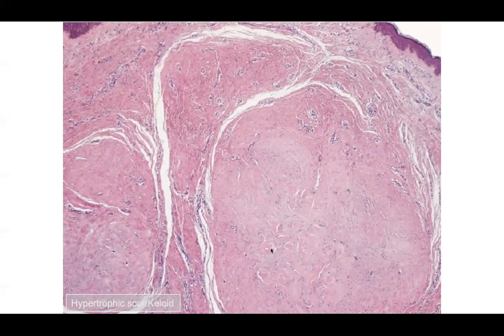There is the beginnings of keloidal collagen in the center of this, but what differentiates a hypertrophic scar from the keloidal collagen is that you'll see pretty normal collagen thickness in strands, but it's going to be arranged in these well-delineated fascicles. And you can often get this at the periphery of a keloid. So if you just get a piece of the side of the keloid, you're going to have mostly hypertrophic scar architecture. And as you start getting more into the keloid, you'll get more of these hot pink bubblegum, very thick collagen collections, and that's your keloidal collagen.